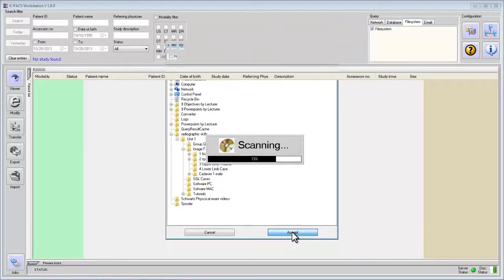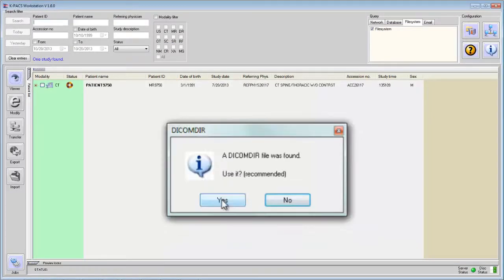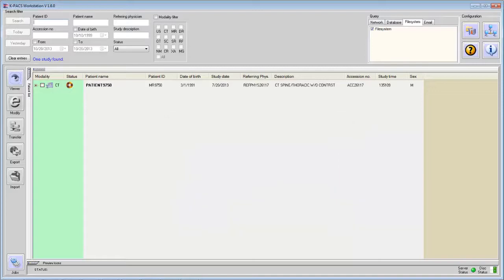Now sometimes we may get a message about accepting a library. In this installation, I did not get that message. But if you get any message that appears, accept them.